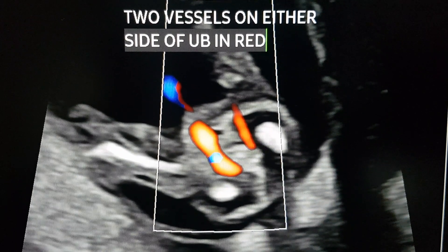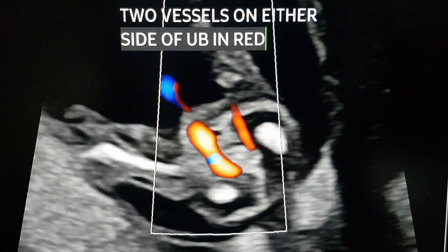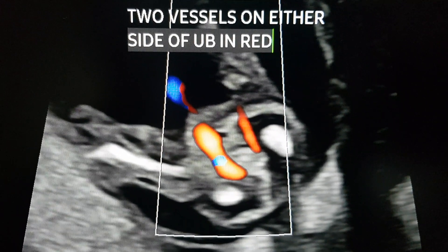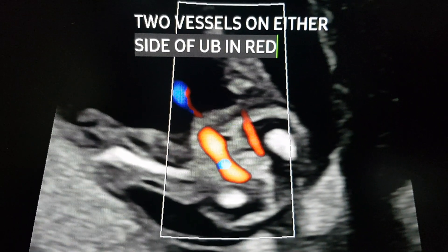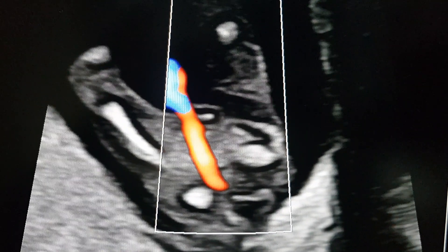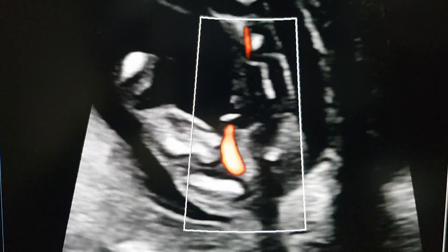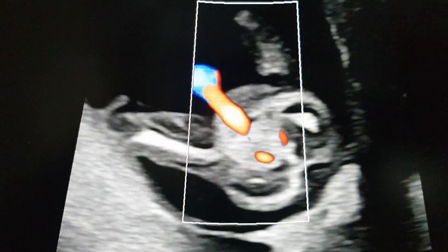But actually, look at the two vessels - they have to converge towards the skin at the level of the umbilicus. But here they are actually parallel. That's the clue suggesting that one may be a single umbilical artery and the other may actually be another vessel. So we do a cine and we can see that it is indeed a single umbilical artery.